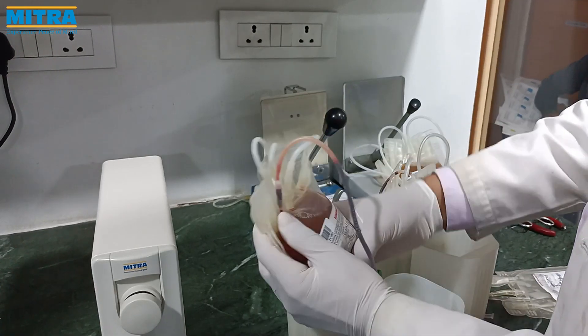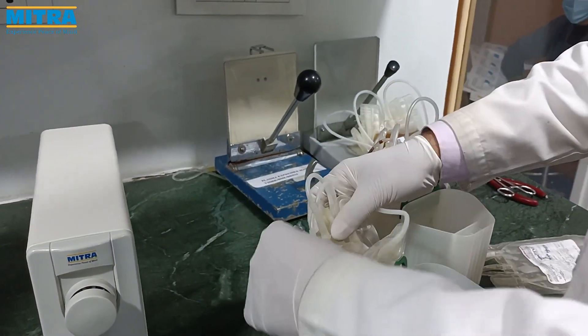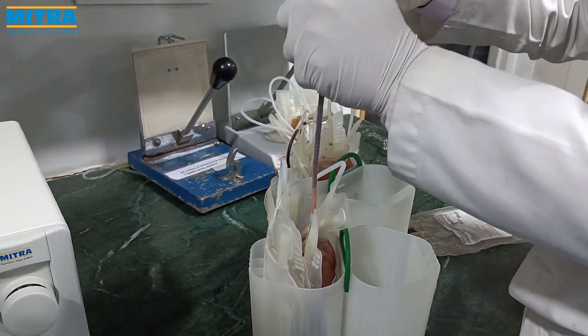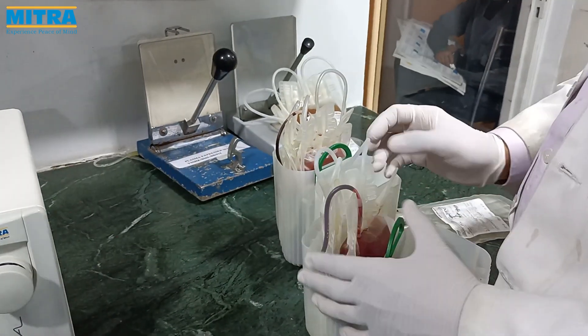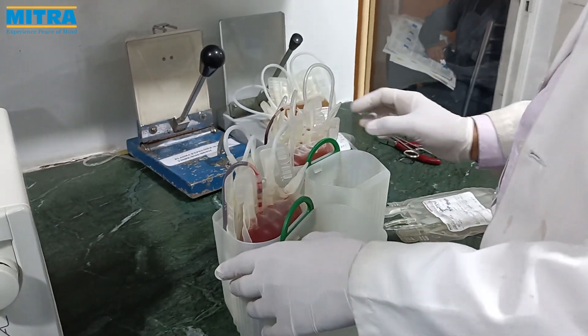Now we witness how to put the bag in the centrifuge bucket — placing the main bag towards the inside facing — and pack all segments behind the bag, packing it tightly so it cannot spill during centrifugation.